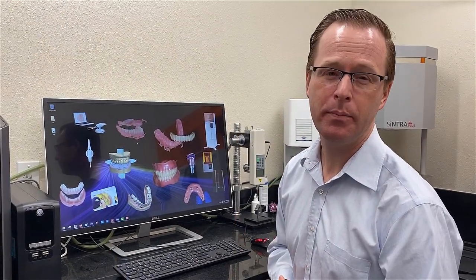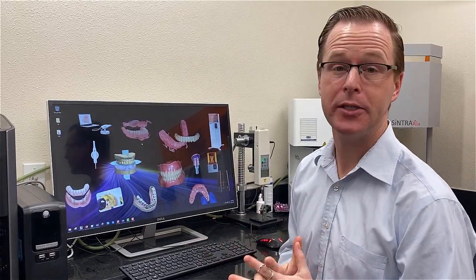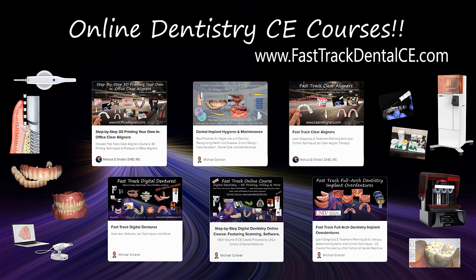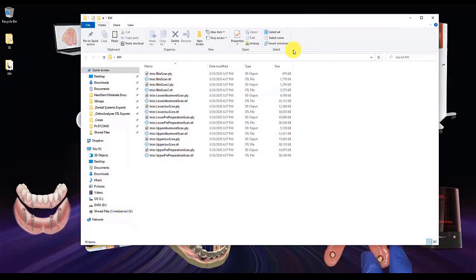Let's go ahead and take a look at our PLY file formats in MeshMixer and some other softwares. So I've gone ahead and I've exported the files here to our patient's folder here on my computer. Just for good measure, I went ahead and I exported as STL, so that way I can compare the mesh density of the PLY file formats from TRIOS and the STL file formats.